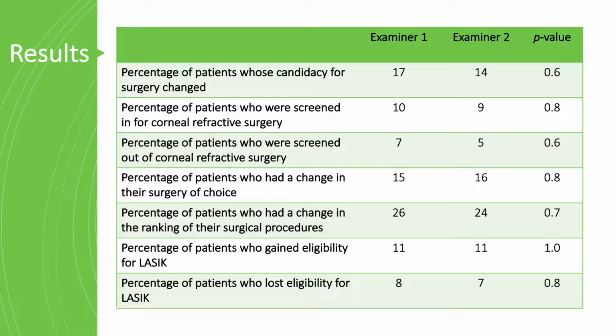Candidacy for corneal refractive surgery changed for 14 to 17% of patients. 9 to 10% were screened in for surgery, while 5 to 7% were screened out.